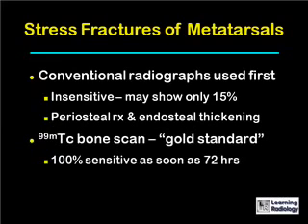Technetium 99M bone scans are considered the gold standard. They are virtually 100% sensitive, and they are sensitive to stress fractures as soon as 72 hours after the injury. Unfortunately, they're not as specific as they are sensitive, so that conventional radiographs need to be obtained in association with the bone scan.